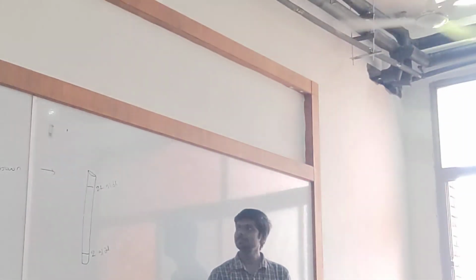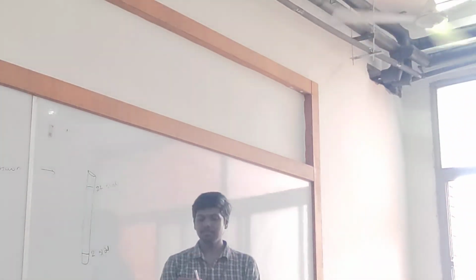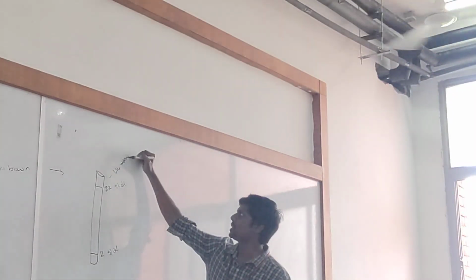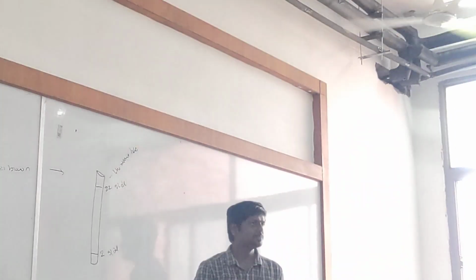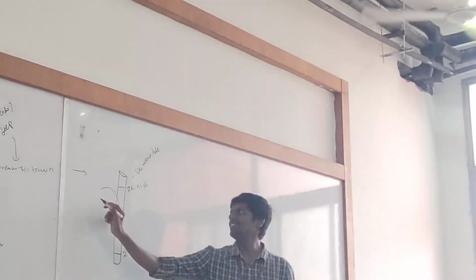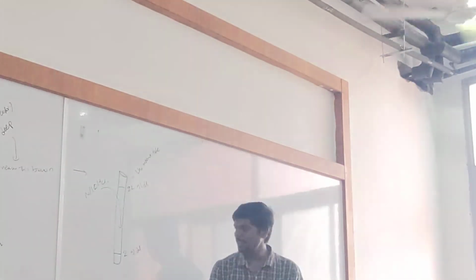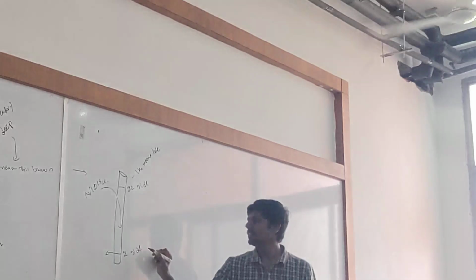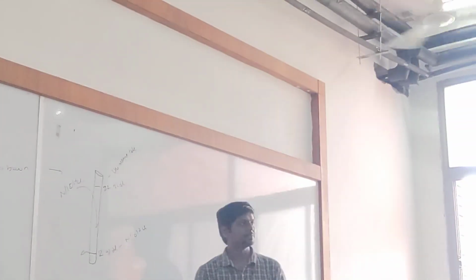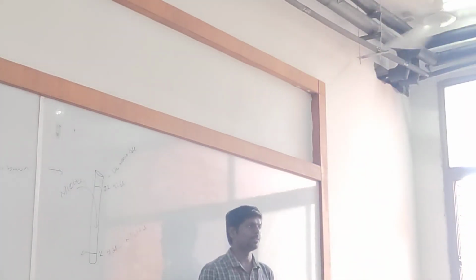Now pay attention. This is called the HB measuring tube. In this tube, he will add N/10 HCl. Up to what? He will add N/10 HCl up to the 2 mark. Clear? We have added N/10 HCl up to the 2 mark.